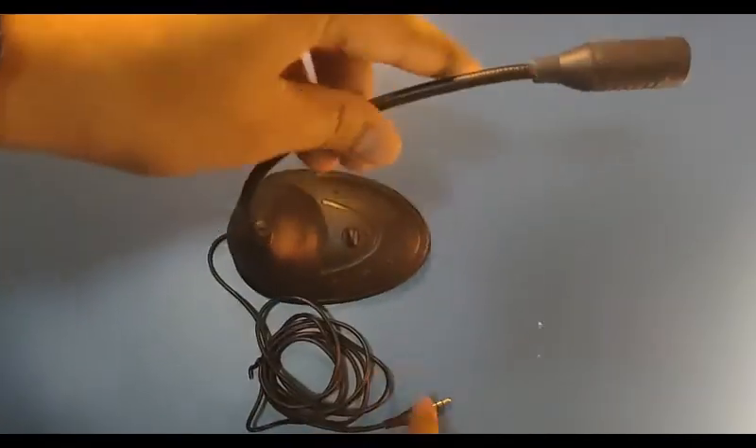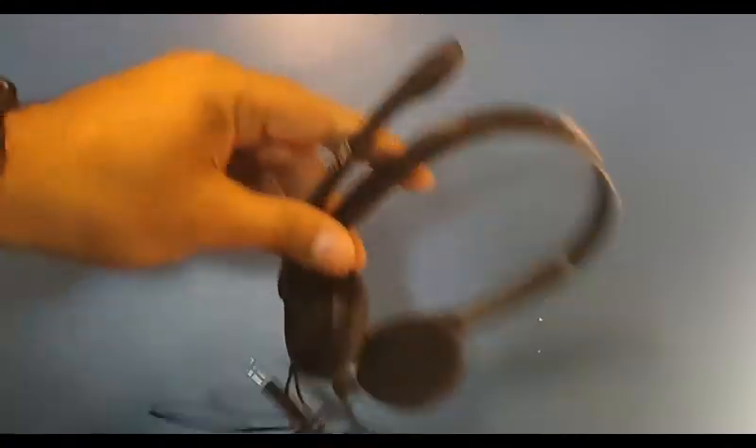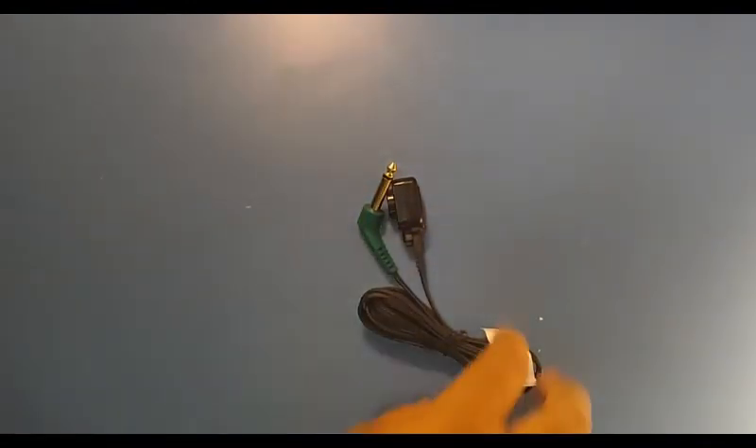In optional accessories, you will get a talk back mic with the audiometer, a talk over headphone with mic, and you can also opt for the B71 bone vibrator with the Audio Mini.